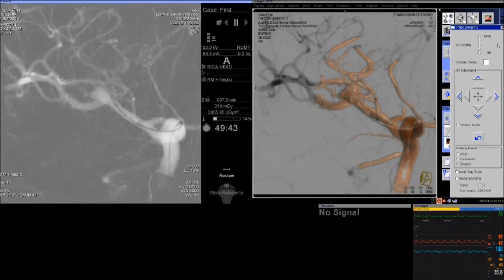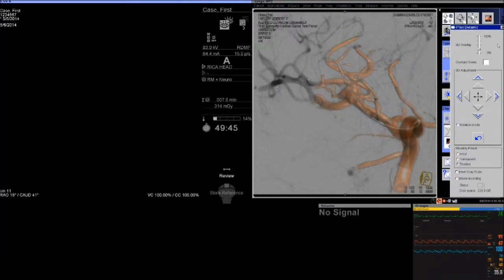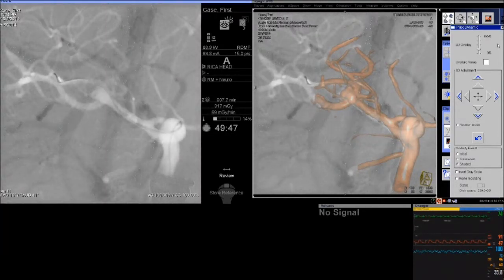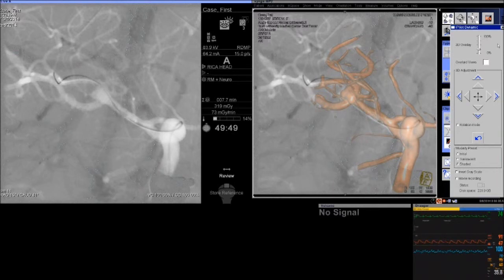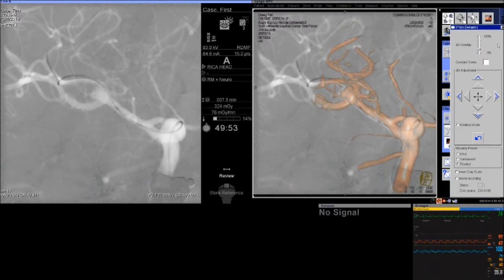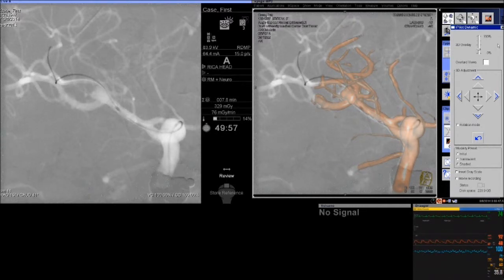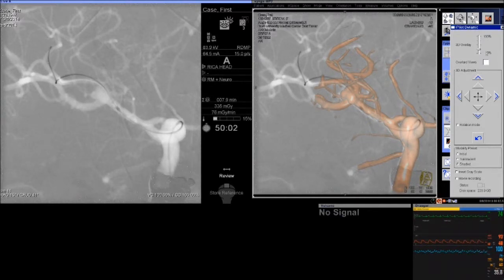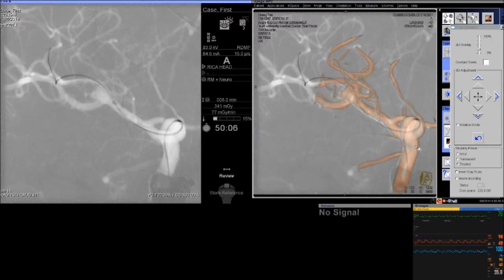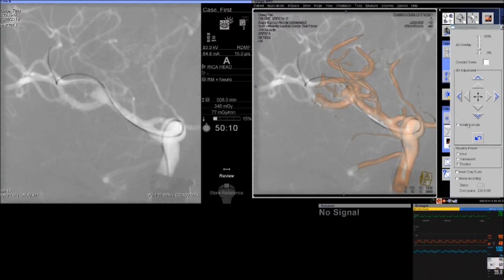This is an important aspect: we have to do a roadmap to look at the distal anatomy. As we position the 0.014 wire, we want to get significant purchase into the distal vessel, but be very careful about not perforating the small vessels as the anatomy gets more distal. You also want to position the transition portion between the soft and more sturdy segment of the wire right at the bifurcation, so the microcatheter passes through the aneurysm area without buckling into it.